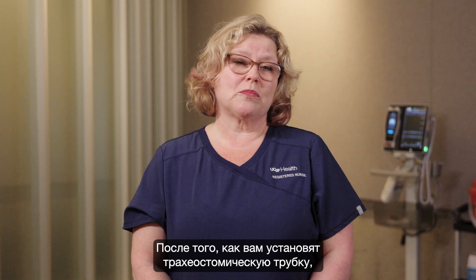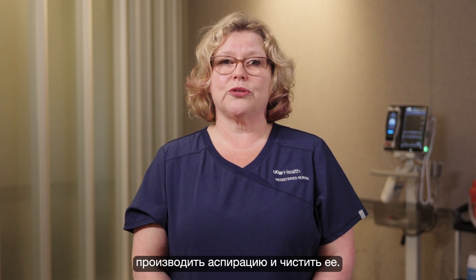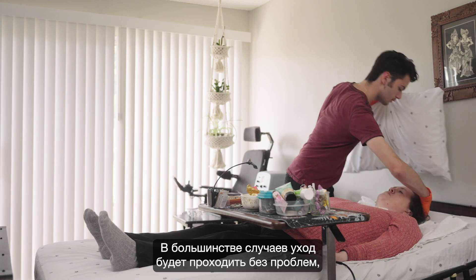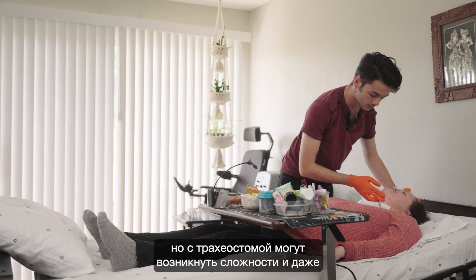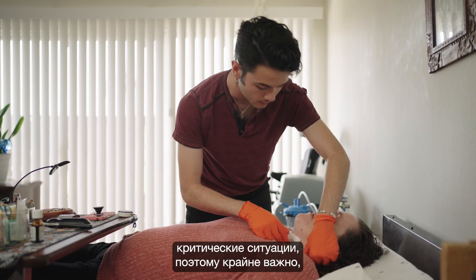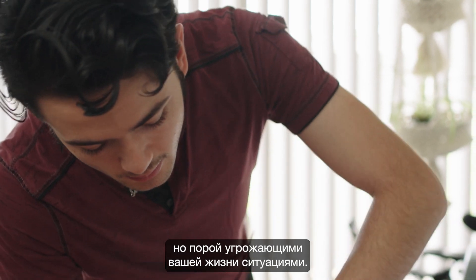Hi, I'm Anu, a critical care resource nurse. After your tracheostomy tube is placed, you'll need to learn how to care for, suction, and clean the trach tube. Most of the time, this care will go smoothly, but challenges and even emergencies related to the trach tube can happen, and it's important that you're prepared to manage these rare but sometimes life-threatening situations.